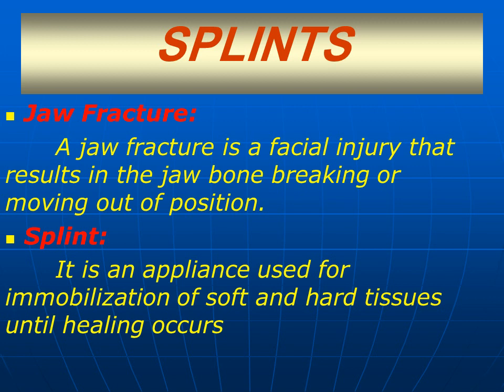Therefore, we can classify splints as a type of stents. Which type? Therapeutic device stents. Why? Because it is used for a therapeutic purpose, which is the treatment of fractures.